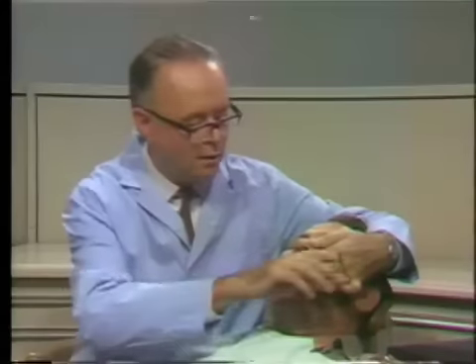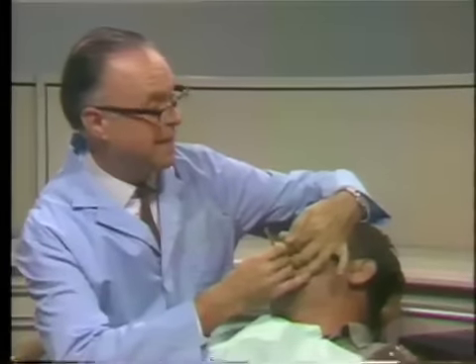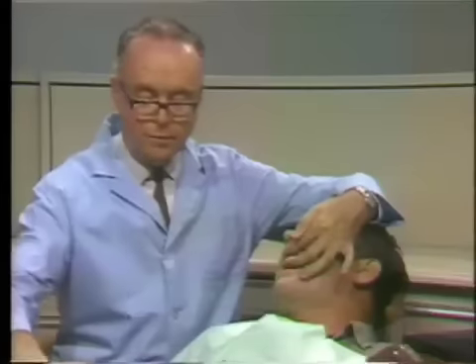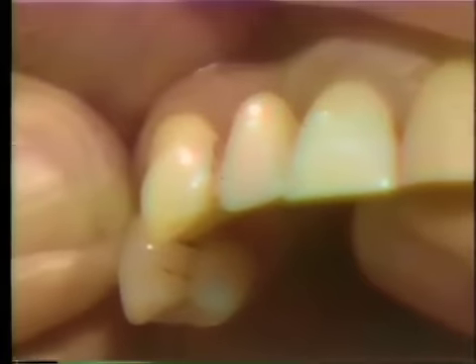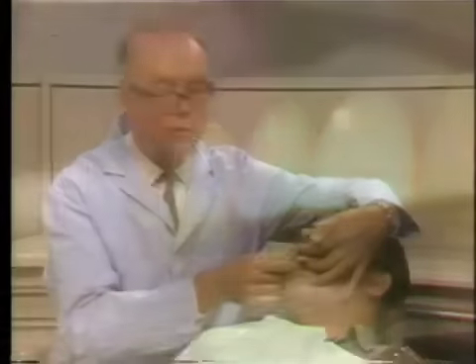We'll take this out now and draw the second line, which will be just lingual to that. And then pop our facing back again and take a look at that second line, which you cannot see because of the relationship of the teeth, and that means that it's just nicely hidden from view there. So we're now ready to go ahead and do the preparations on the pin ledges, which is not something that we're going to cover today, so we'll stop at this particular point.